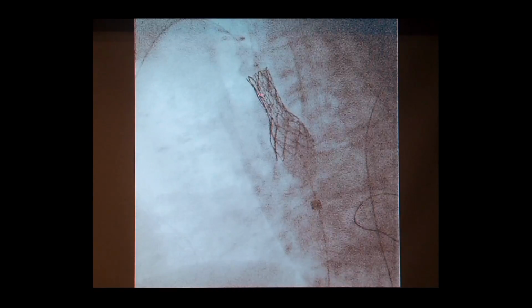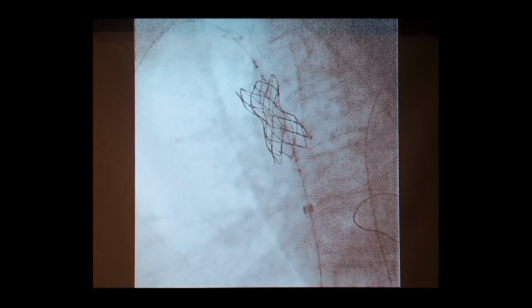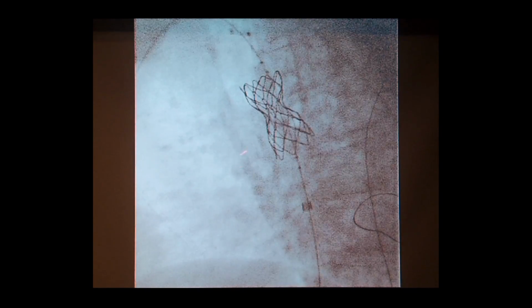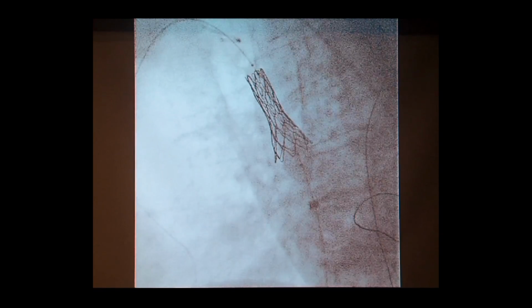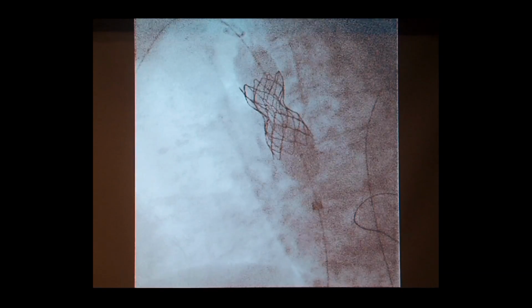We've gone with a stent in here across this, and you've got to bear in mind this orifice is about 2 millimeters when we started off, and that's a 16 millimeter diameter stent. So we have gone ahead and made it bigger by 8 times or thereabouts, because you need something of that size to make blood flow freely through. And of course, there is a risk these things can rupture, so we use special stents called covered stents, to try and minimize the risk of the rupture. And that is the final result.